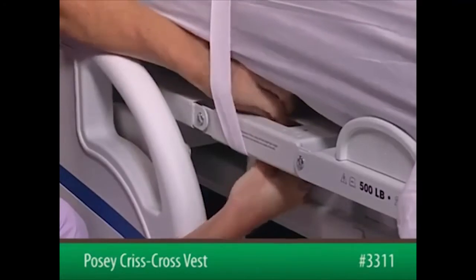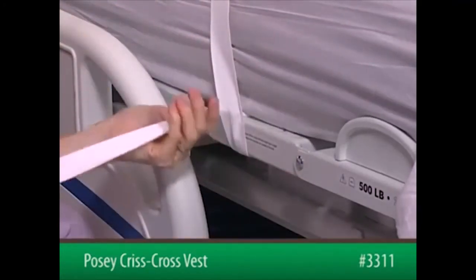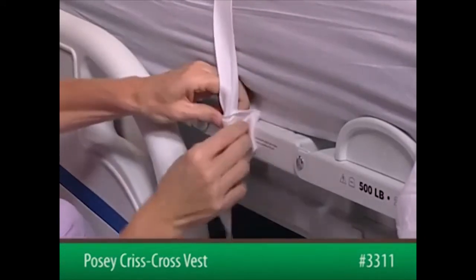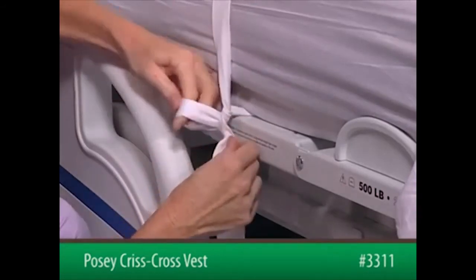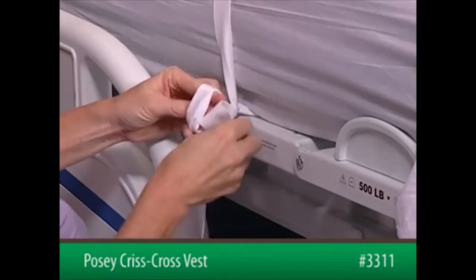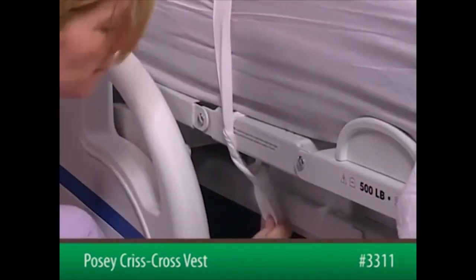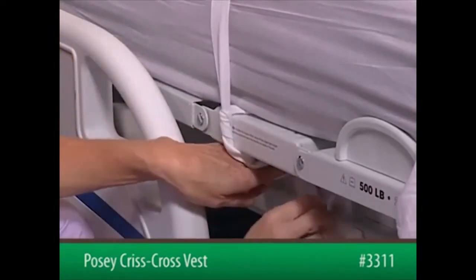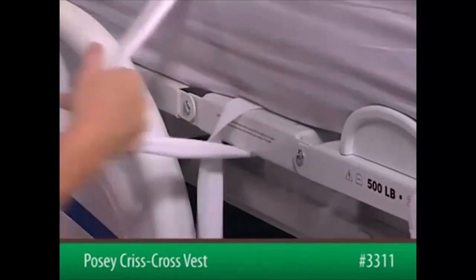Wrap the strap around the outer side of a movable part of the bed frame at waist level. Bring the strap across and then behind the vertical strap to form a loop. Take the end of the strap, form a second loop, and bring it through the first loop. Pull to tighten and tuck any excess strap out of reach. To release, pull on the tail of the strap.